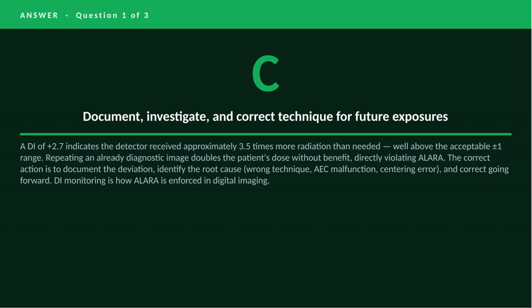Adjusting the window width changes how the image is displayed. It does not change the dose or the underlying data. Document, investigate, and correct. That is the correct ALARA response.